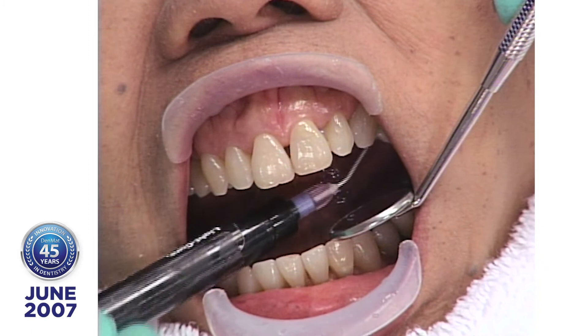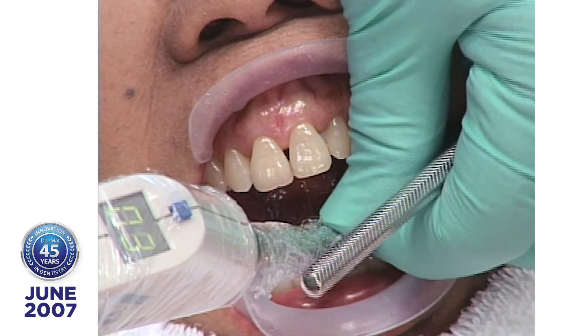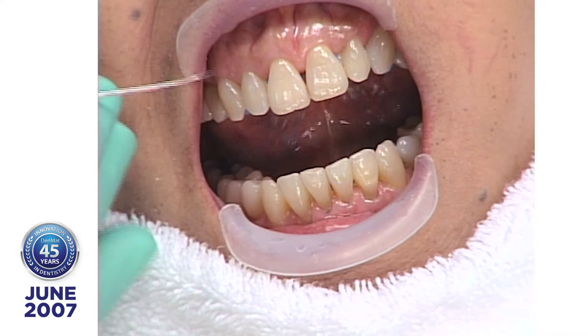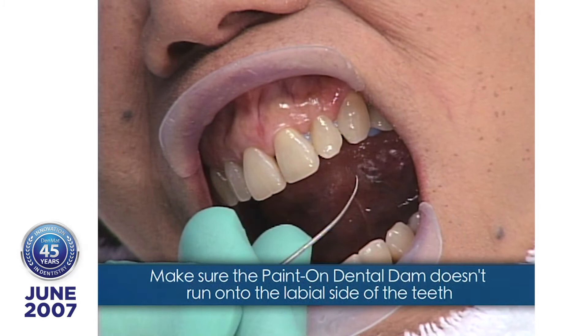Close your eyes — the best way to protect your eyes is to close them. I put the sapphire light with the 9mm tip where I want to place it, turn the light on for 3 seconds and get it cured to a rubbery state. Now I want to show you where the paint-on Dental Dam is coming through to the labial — I want to be sure it goes back so it doesn't prevent the lumineer from seating. I'll let everyone see what it looks like on the lingual side.